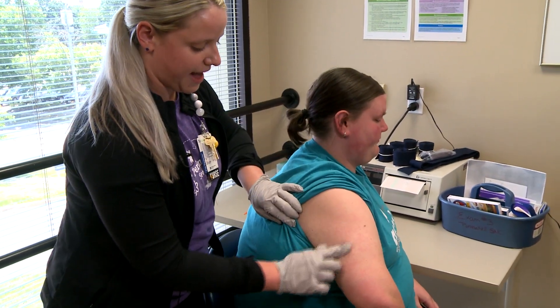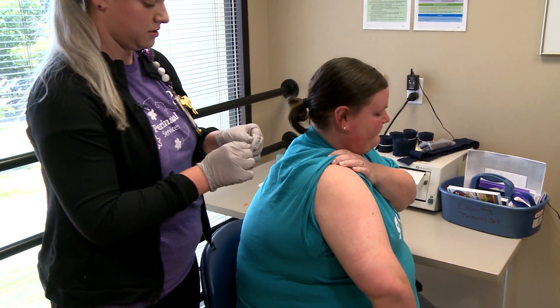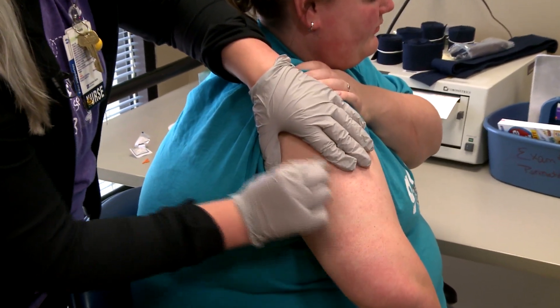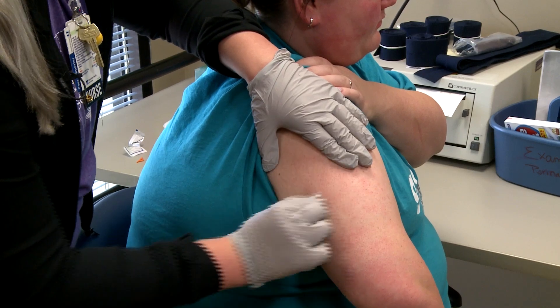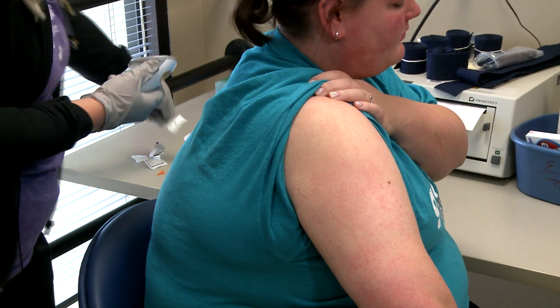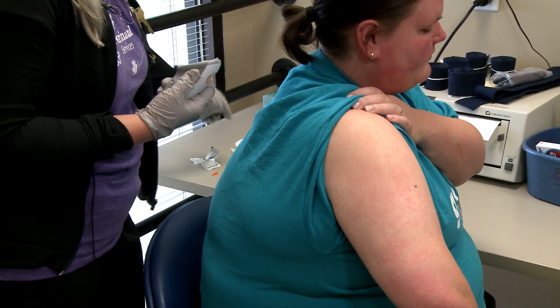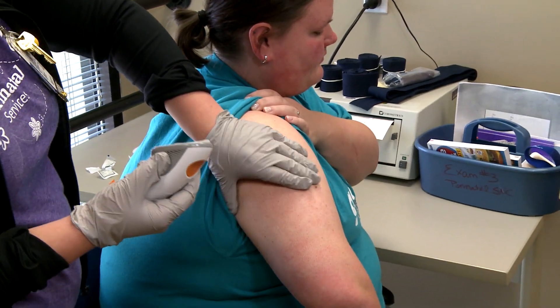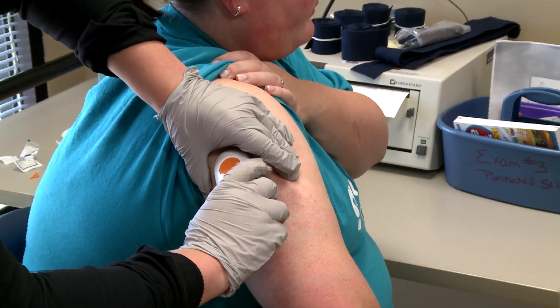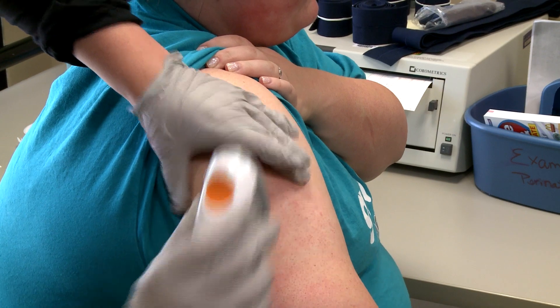We're just going to go in the back of the arm in this area. You will clean off the area with an alcohol swab. Let that dry for a few seconds. I'm going to hold the area that I'm going to place it, put it on like this, and then one, two, three — hit that orange button, and you're good to go.